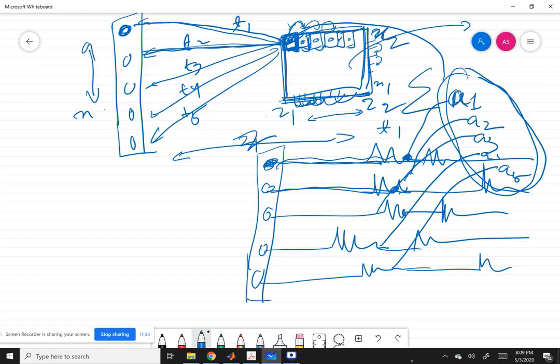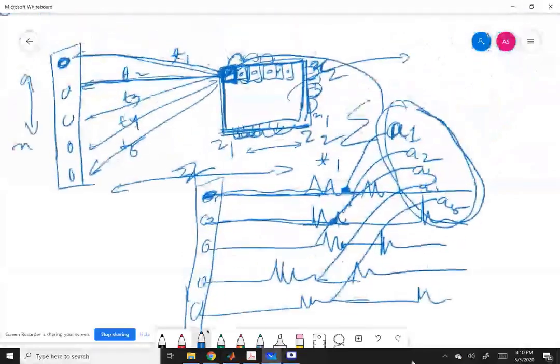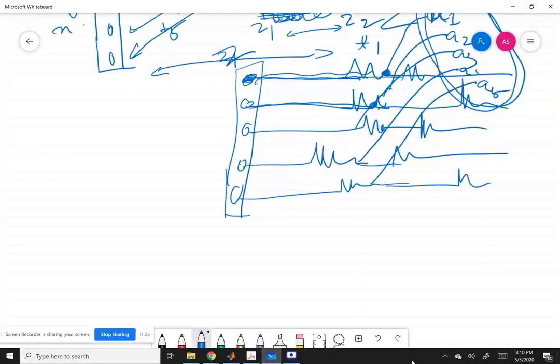Okay, on x and y dimension. So depending on how closely or how sharply you want to reconstruct the images, you can choose these dimensionalities and these locations. So initially you get a bunch of radio frequencies, then you use the radio frequencies to reconstruct your images. Okay, so that's the overall idea of how we do ultrasound image reconstruction.